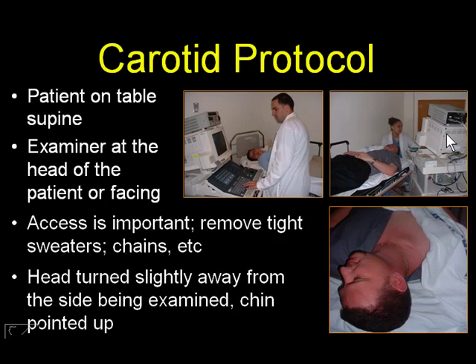In terms of the examination itself, we like to test our patients on the examination table with the patient supine. As you can see in these images, it's okay to examine the patient by standing up and facing the patient, or you can sit at the patient's head. I think either one is okay, and I think you should do whatever you feel most comfortable doing.